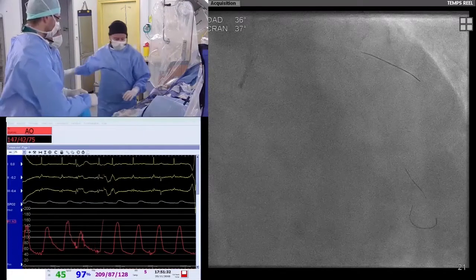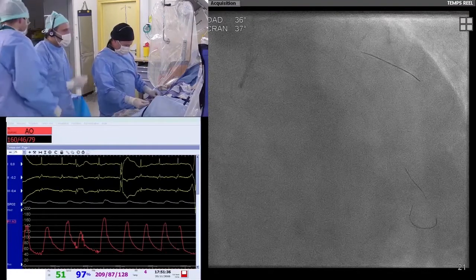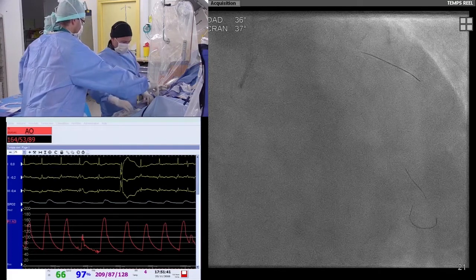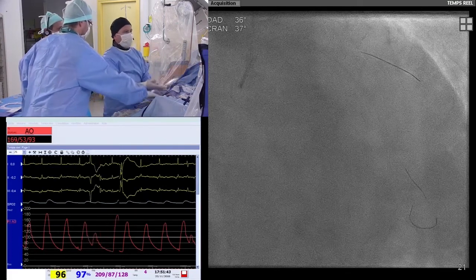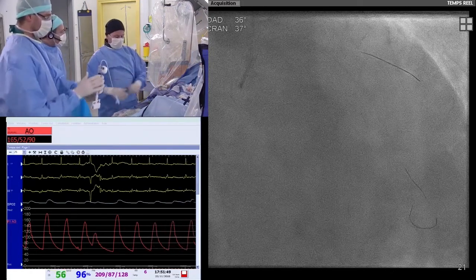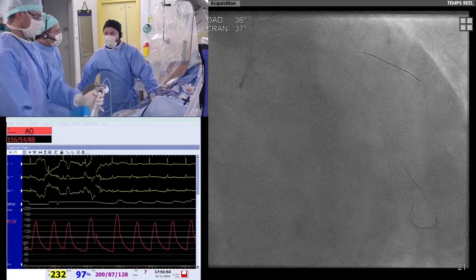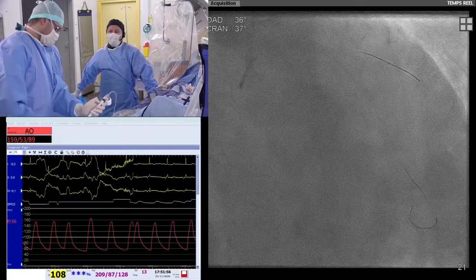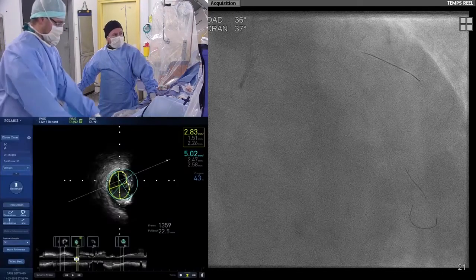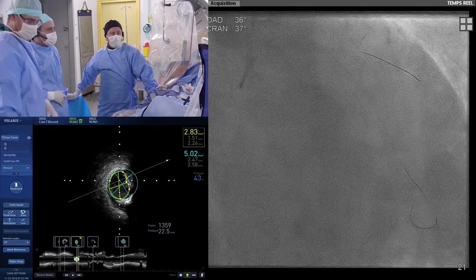I think I agree, because if you need to stent the left main, it means taking back this beautiful supportive rota wire there. Since we have to put a long stent in the LAD, this is the perfect situation to advance a long stent. So how about now stent selection? As you can see, using the IVUS, the distal part is 3 mm diameter. So about the length, I think we can use a long stent, a 48 maybe.